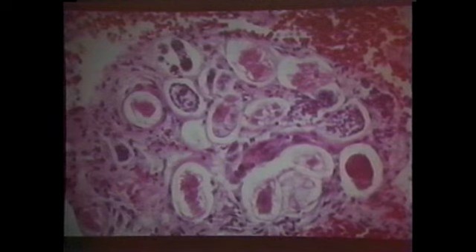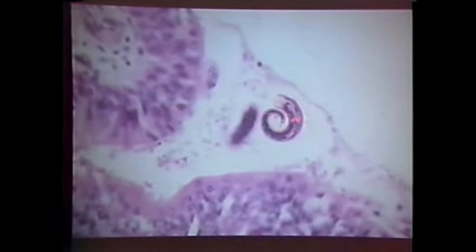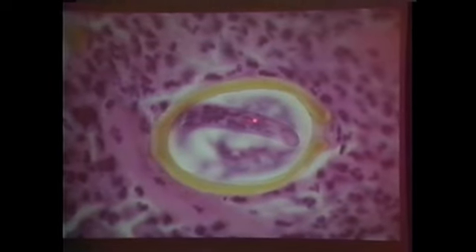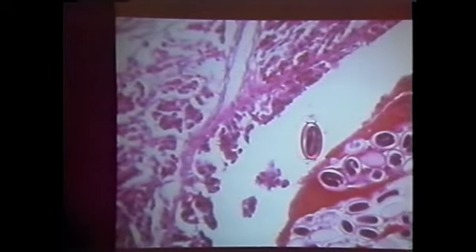And in some of your lungworm larvae, you can look at the tail, because some genera of lungworm larvae have specific types of little hooks and points on the tail, and you can use that. Sometimes the eggs will be colored. Sometimes they will have larvae, and they'll have nice little filaments at either end. And you'll use this to match up what you think it is.